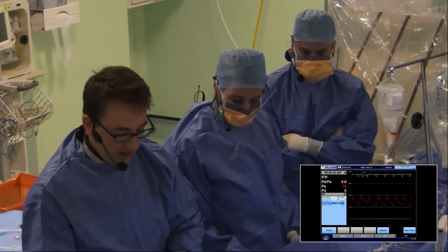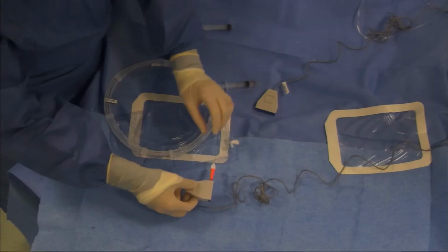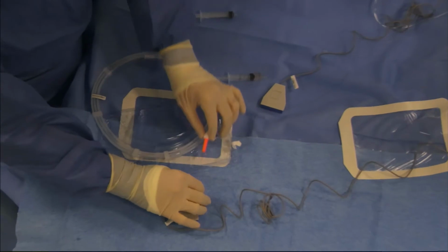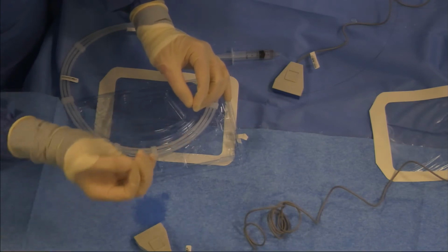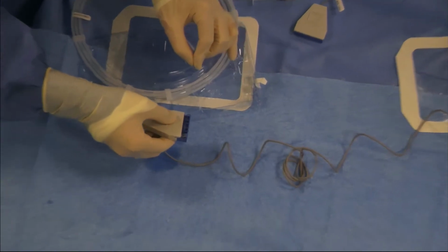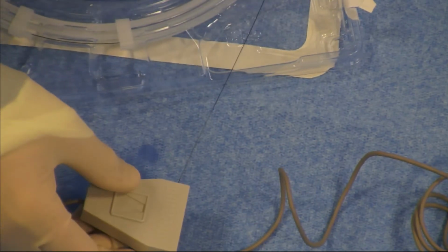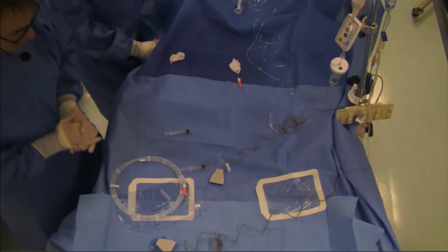So the next thing I'm going to do is effectively just look at the pressure wire very, very briefly here. Of course, I've connected the pressure wire which we've used already, not the one which I've been unpacking. But just by means of demonstration, you can see that these pressure wires now come with a different connector. Rather than having to feed the wire into a little tiny hole, which has been the case for most of the life of pressure wires, now there's an end-on connector that slides in very, very easily and simply, which enables us to connect and reconnect the wire during the case. So this can be very useful if you want to perform PCI, IVUS, or other forms of imaging over the wire, or ballooning or stenting, of course, over the wire as well.